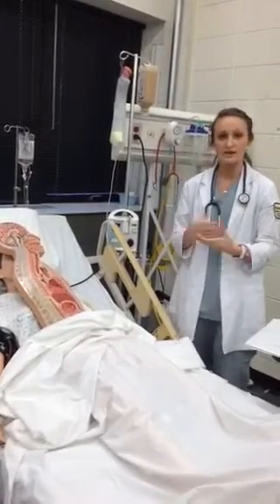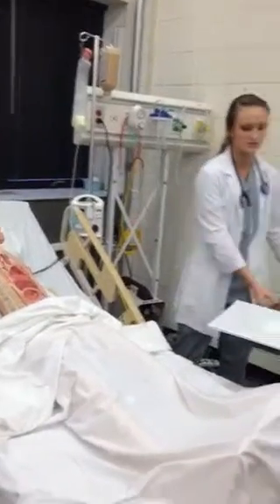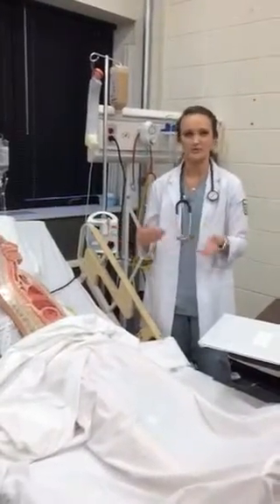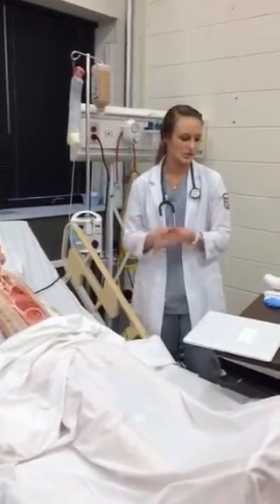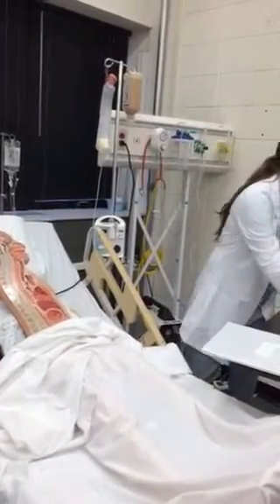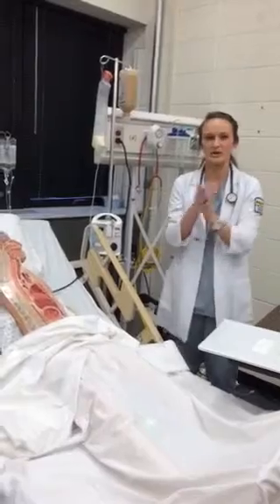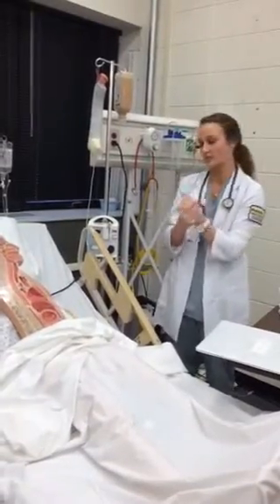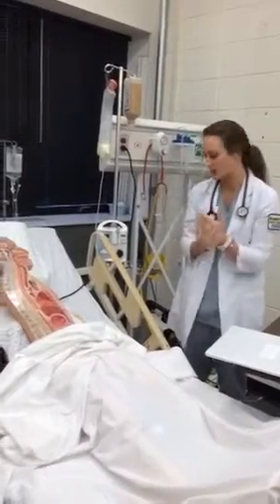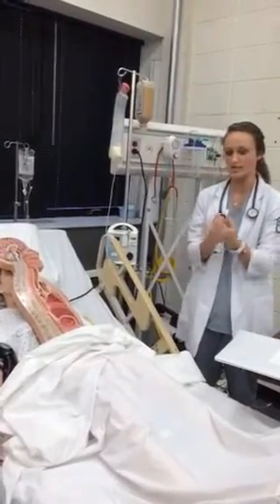And once I've done that, I'm going to go ahead and gather all of my supplies. So they are over here. And when I go into the patient's room, I'm going to knock, enter, identify myself, greet the patient, and wash my hands. I'll provide for privacy, and I'll identify the patient by two means. So I'll ask them their name and their birthday and check that with their wristband.